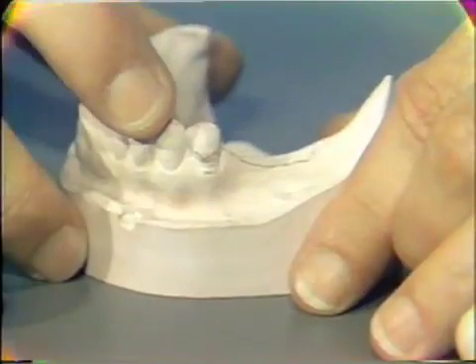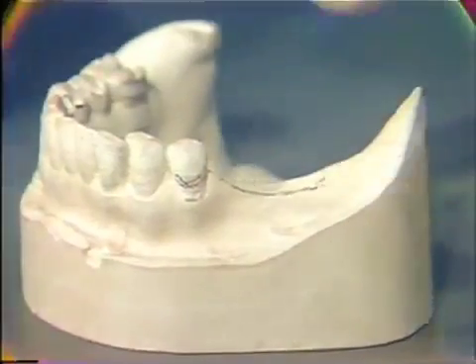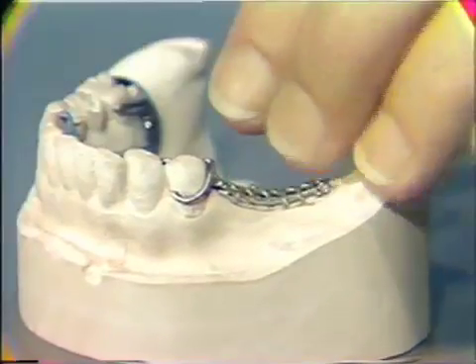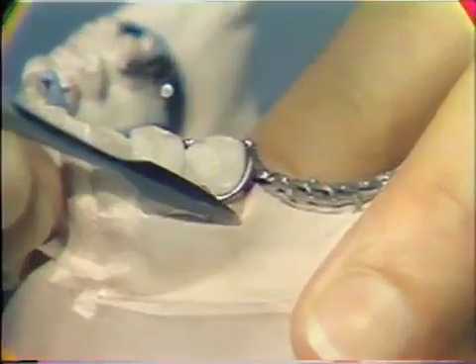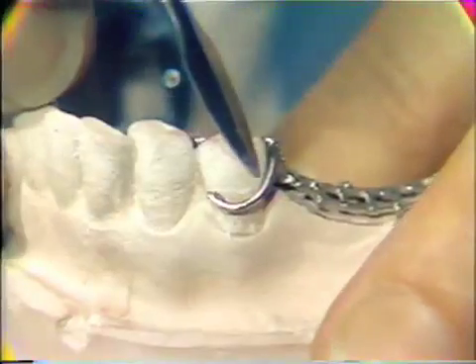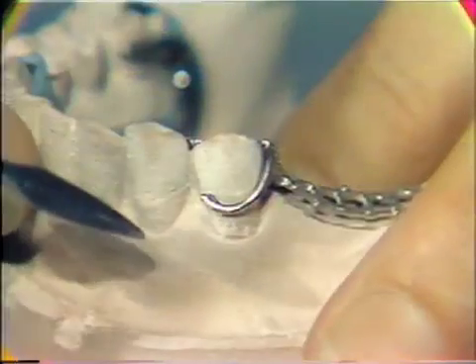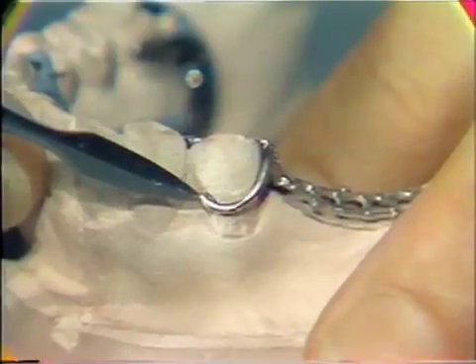If the survey lines and design had not been drawn on the MasterCast prior to this time, they must be done before we adapt the wire to the MasterCast. The wire itself must conform to the abutment tooth so as to engage the correct amount of undercut at the middle of the buccal of the tooth, be away from the abutment tooth at the distal buccal, and sweep upwards and be slightly away from the tooth at the mesial buccal.